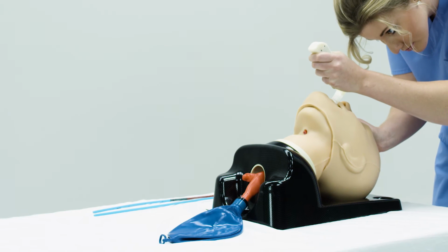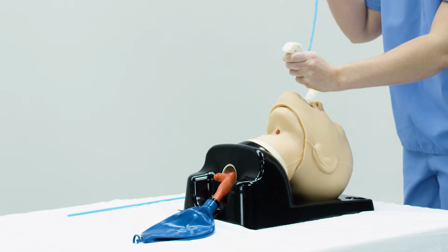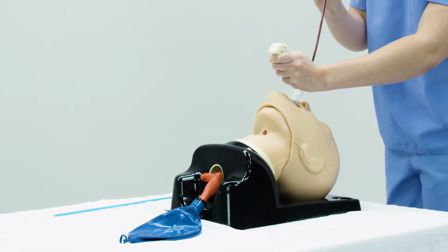Unlike a traditional laryngoscope, the movement to see the vocal cords is in the user's wrist, with a gentle rotation of the scope using the upper teeth or gum as a fulcrum. The teeth are protected by a silicone tooth protector, which is on the scope.